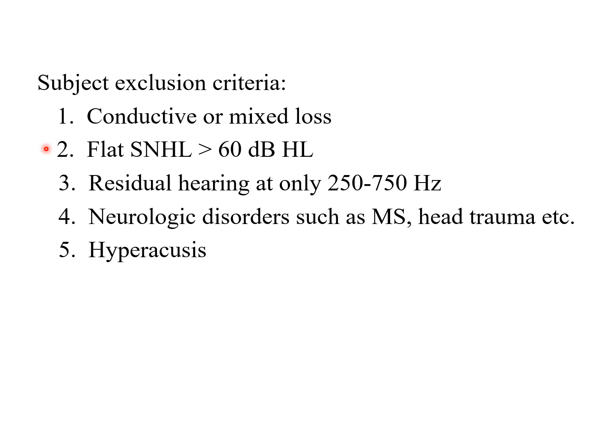Also, if the patient has residual hearing only at the low frequency region, that will compromise the stacked ABR performance as well. Or if the patients have neurological disorders such as multiple sclerosis, head trauma, and so on, those will affect the accuracy of stacked ABRs. Or in patients with hyperacusis. Hyperacusis usually is a result of abnormal recruitment.